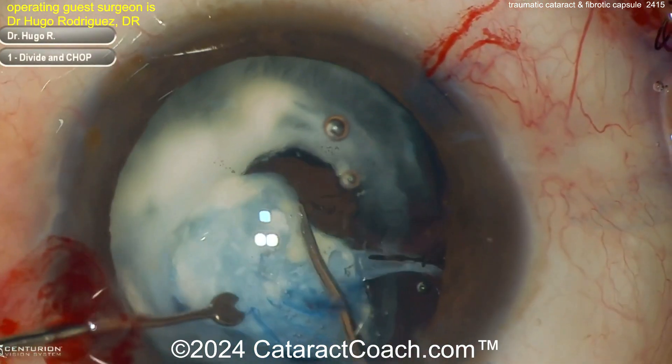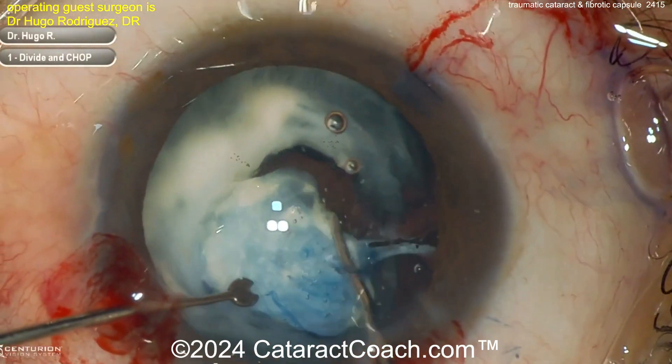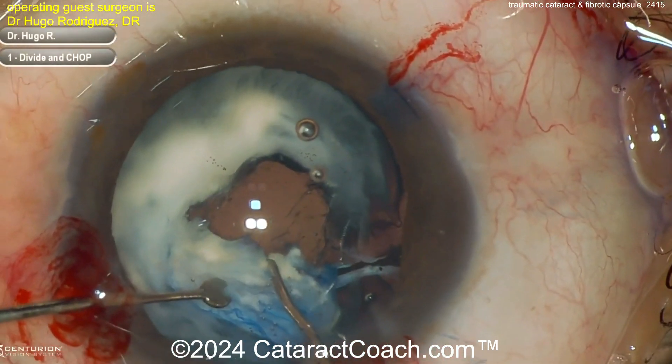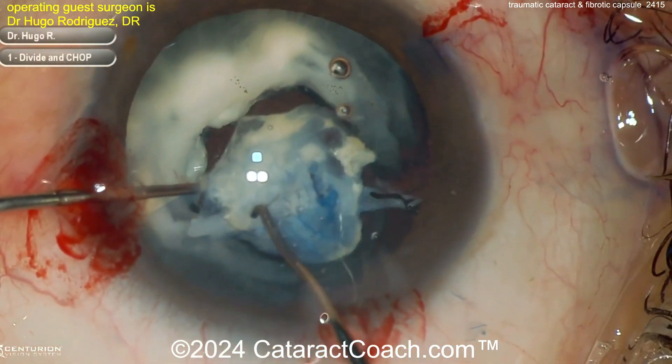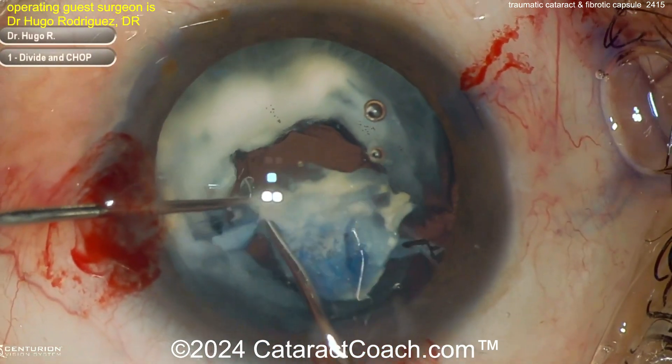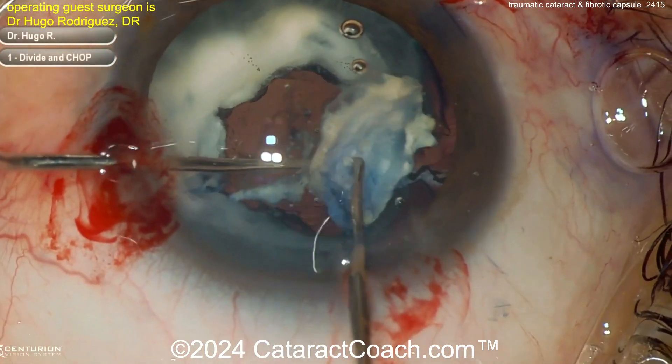You may have to use something like sharp scissors, or here — it looks like a Sinskey hook — trying to just separate out some of the lens material. Clearly this patient had a rupture of the lens capsule from the injury, and you see leakage of lens material that became liquefied later.